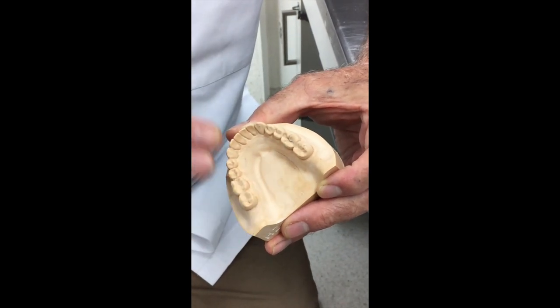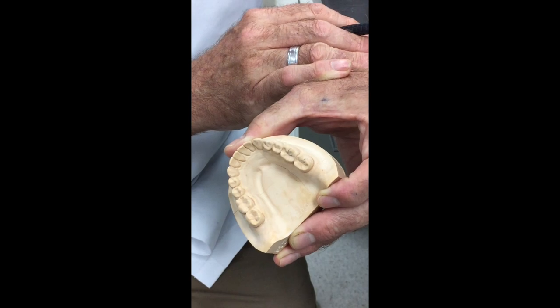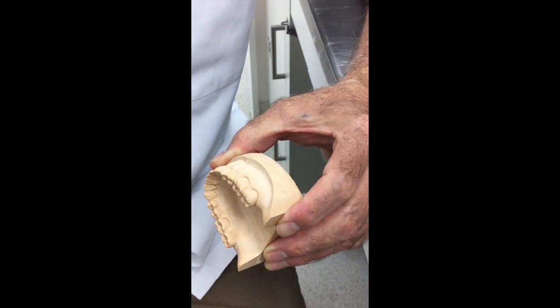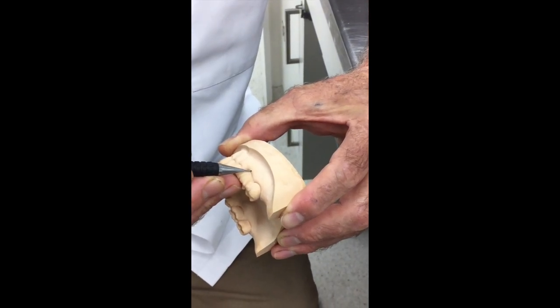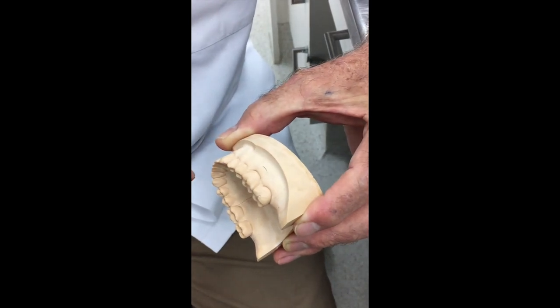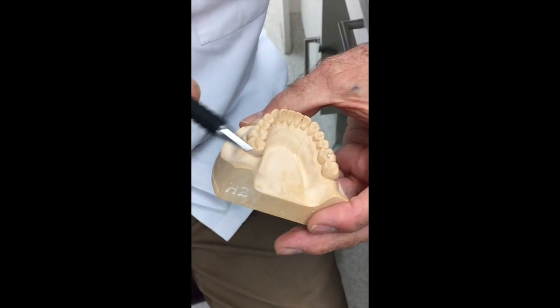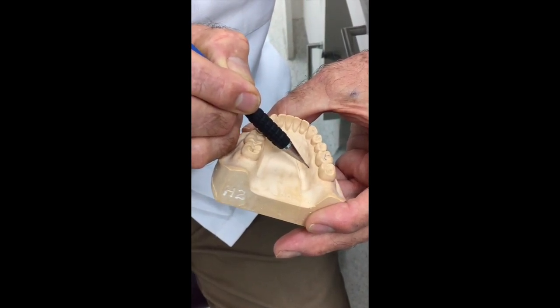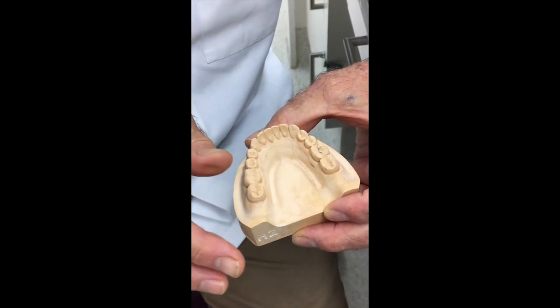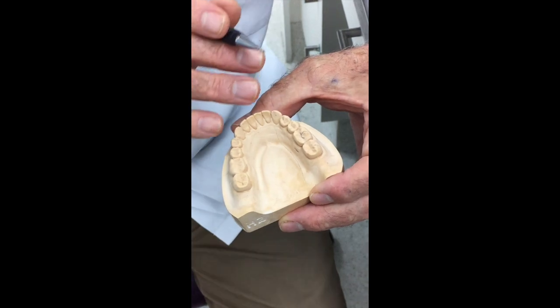Then we need a tray to be just enough to capture the occlusal surface of all of the teeth and particularly the gingival area around the nominated tooth that we're going to be cutting the prep on. So in this case, it's this tooth here. So the general rule would be for our tray to extend about 4 millimetres below the gingiva in that area. So let's look at that distance there. And it's both on the buccal and on the lingual side, about 4 millimetres below the gingiva. Okay, that's just to ensure that we have nice coverage around that area and we're going to capture the margins of that tooth that have been retracted and so on.